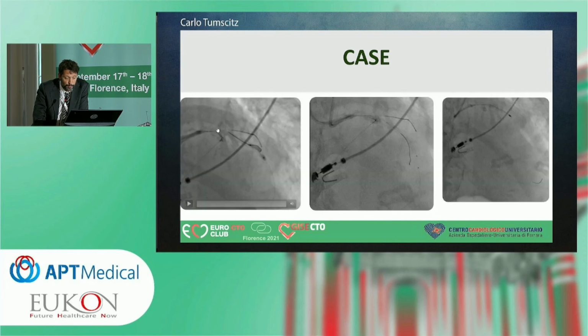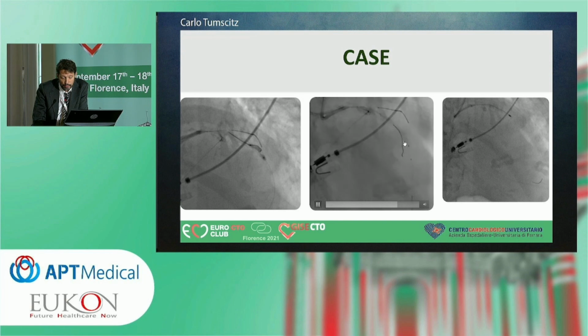So we decided to predilate over the RG3, externalized from the same catheter. So we have just one catheter working, but there was some calcium here, huge calcification, and the balloon was indented like this. So we decided to place another microcatheter to go down with a Rota wire down in the LAD. So you can see the 2 microcatheters facing one another. It's like a rendezvous.